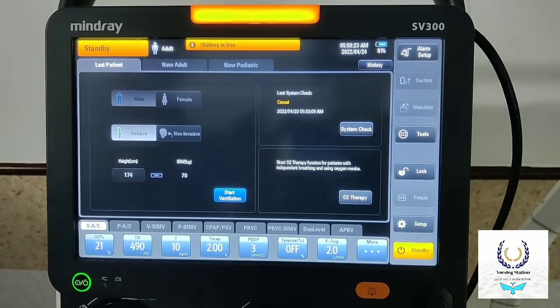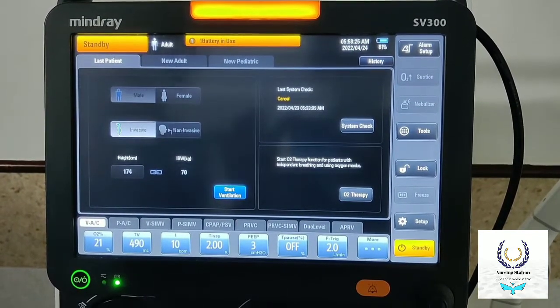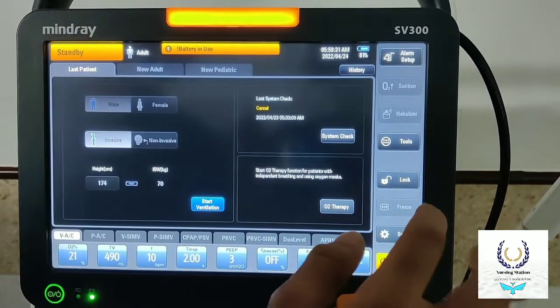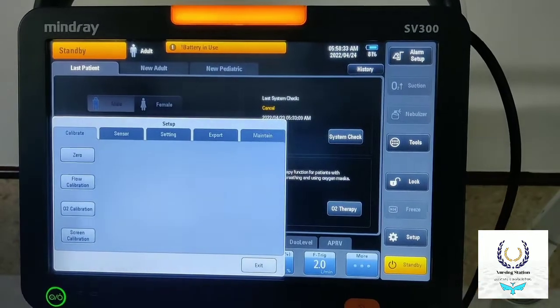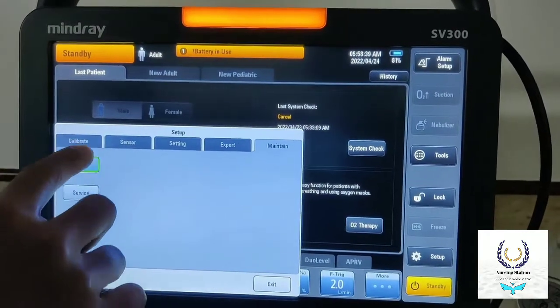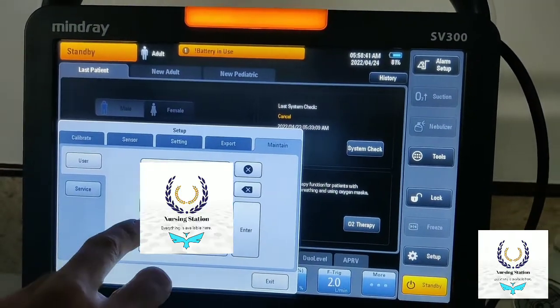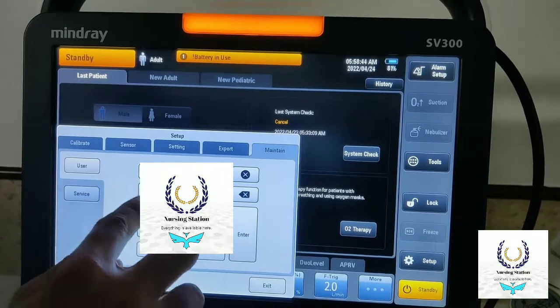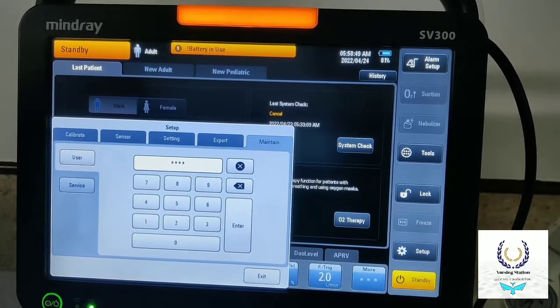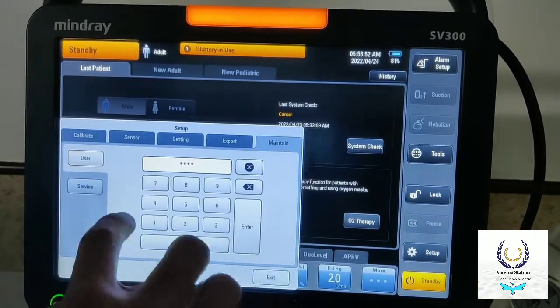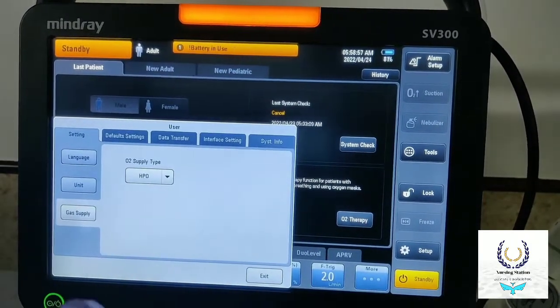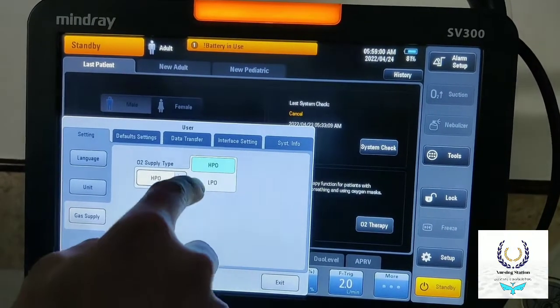Today we are going to discuss how to convert a main drive ventilator to a portable ventilator. First of all, go to Setup, then select the Maintain option, then go to User. Enter the password — if you don't know the password, you can inquire with the manufacturer or with your biomedical department. After putting the password, press the Enter button.